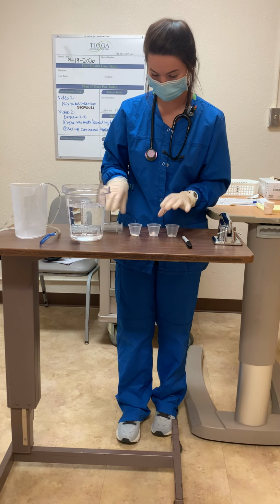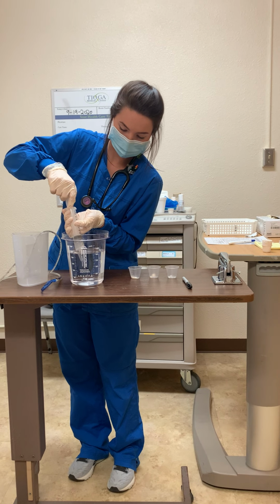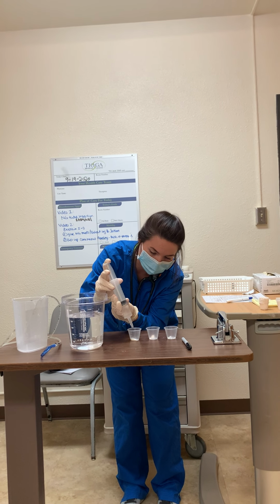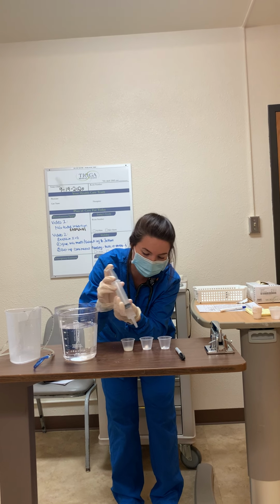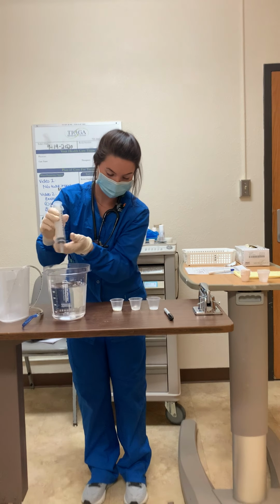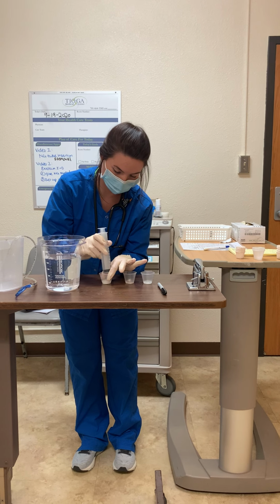Okay, so then first, I'm just gonna go ahead and draw up some water here. You wanna make sure it's room temperature. And I'm gonna be putting about 5 or so in each cup, just enough to dissolve my medication. Okay, and I'm just gonna go ahead and stir them around really well so we make sure everything is dissolved.